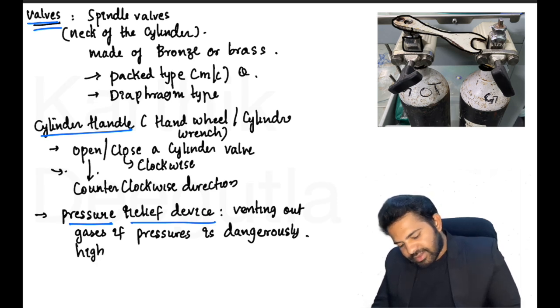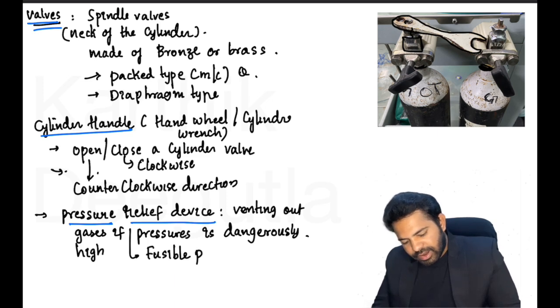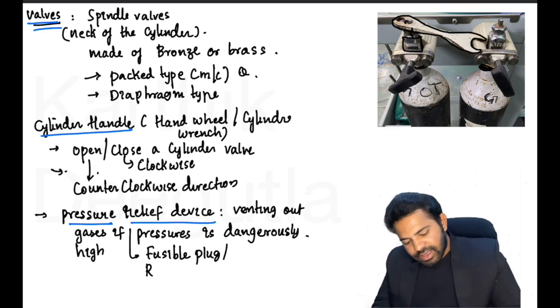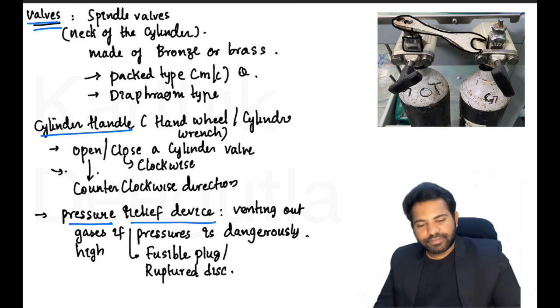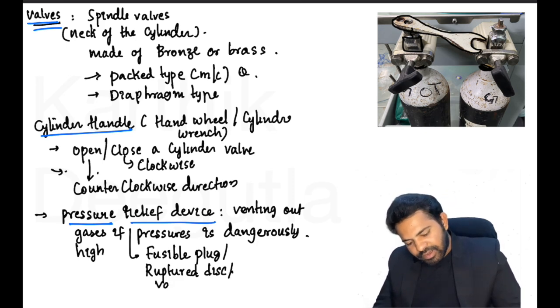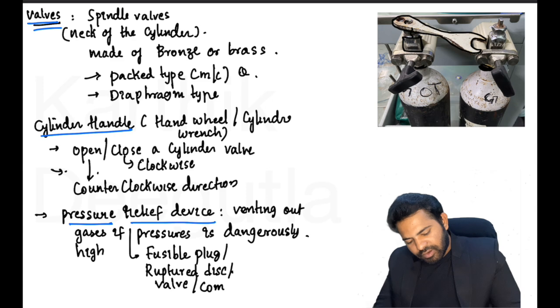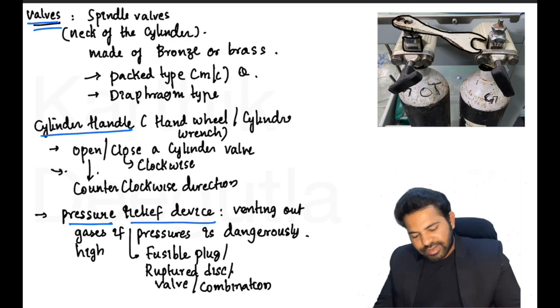The pressure relief device is also known as a fusible plug, or a rupture disc. These are the types of pressure relief devices available. It could be a fusible plug, a rupture disc, a pressure relief valve, or a combination of all these three. Alright, I hope this is clear.